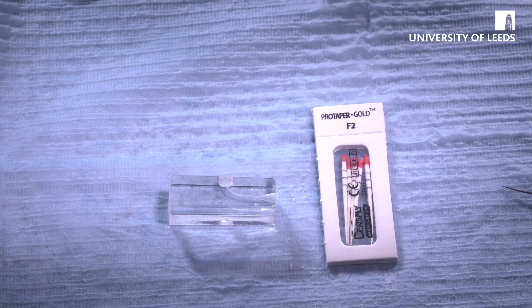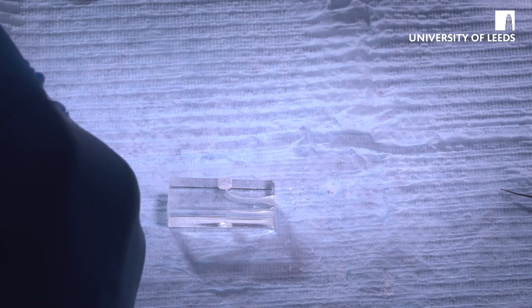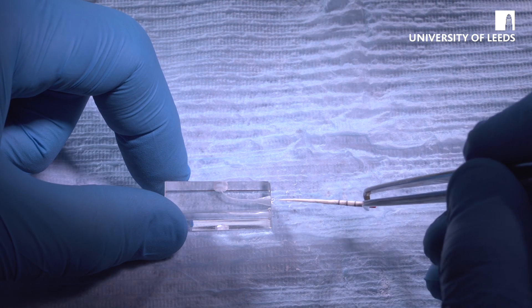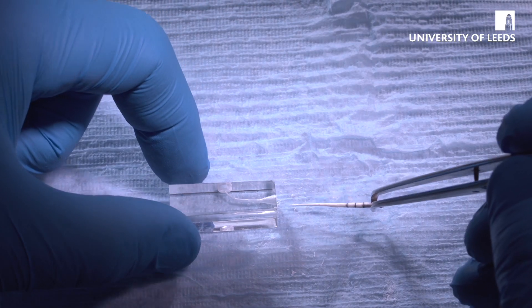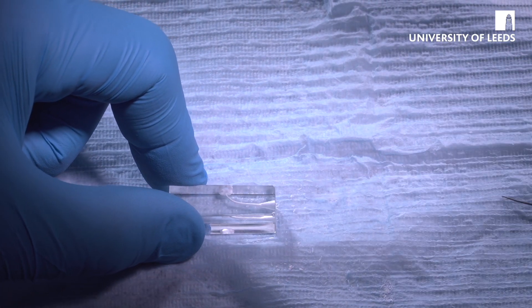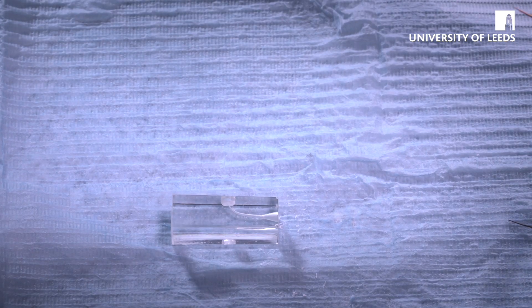Again, we have match cones, so open those up. Place a cone in just to dry it off. Place another one in — it should come out dry if the canal is dry, which it does. Then take our cone.